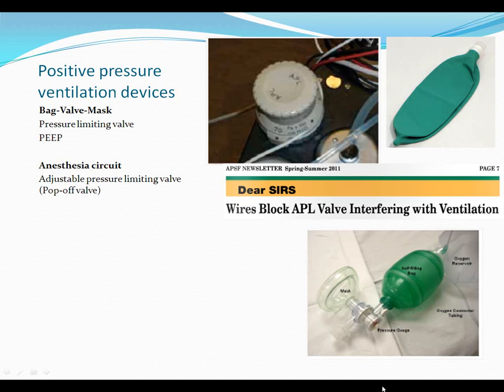Obviously, you are probably very familiar with how this APL works and what you're doing. But I just thought it's nice to step back and think about what you're really doing. So what happens when you're squeezing the bag and holding the mask?